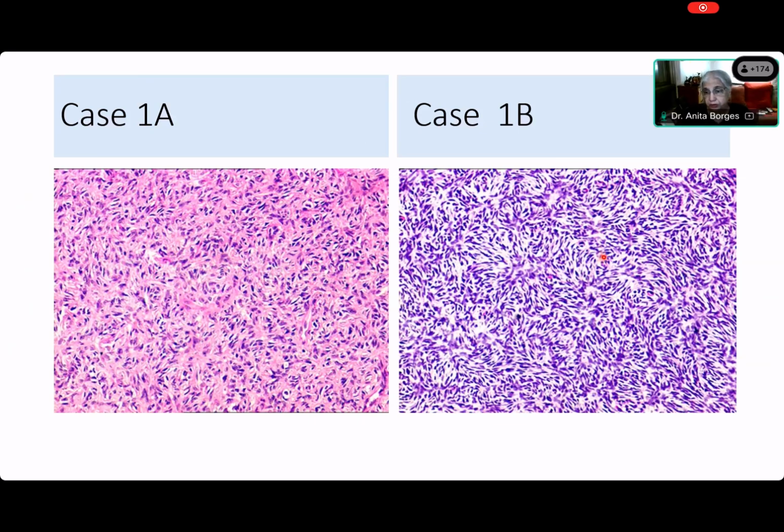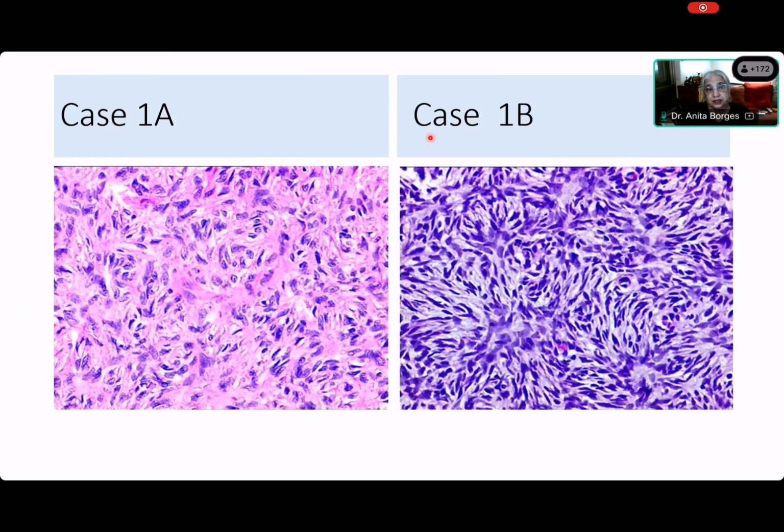Diksha, you have a problem? No, ma'am. Anybody has a problem with storiform? In the chat box, is anybody saying that they have a problem? I hope not, because this is as storiform as you can get. Now you can see this entire part. There you have that central point from which, look at this beautiful storiform. Here, everywhere. This is much more storiform, but one is less storiform than the other. But this is storiform. Okay?